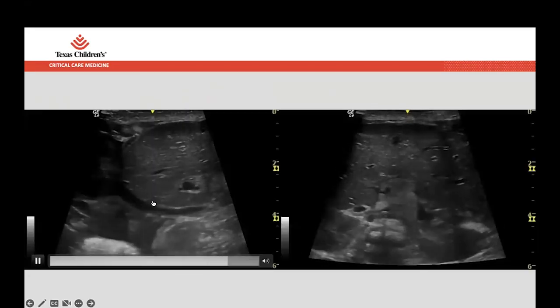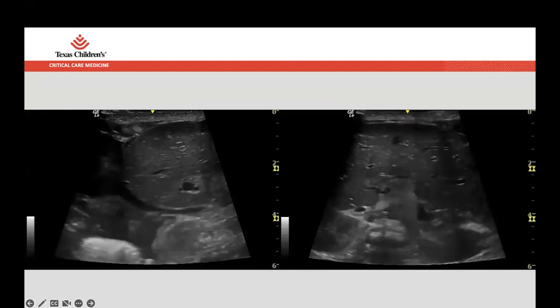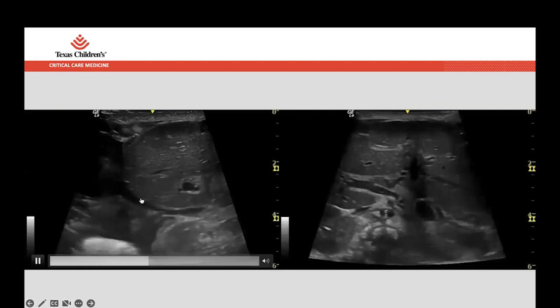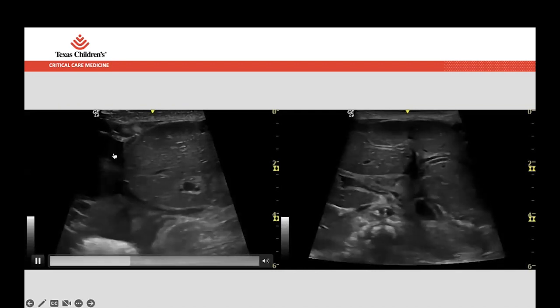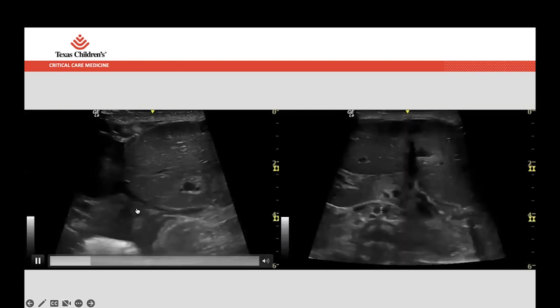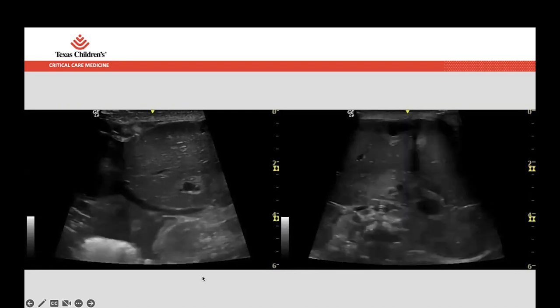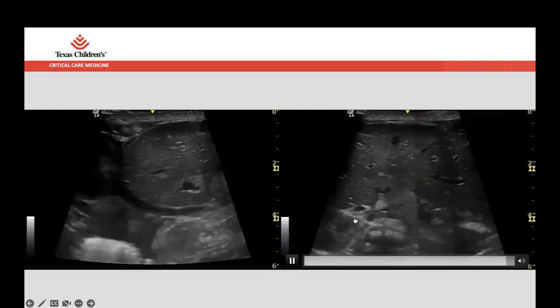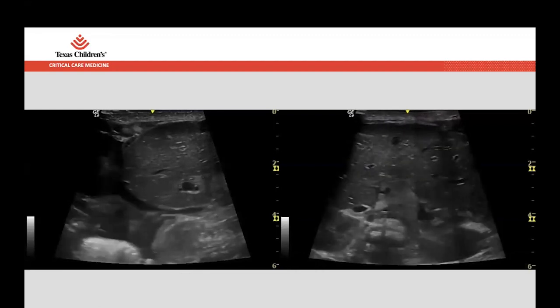You can see that also, if you look at the IVC, it's pretty collapsed as well. And we always have to caveat this; we'll be having this more in a volume status lecture later. This is a sagittal view where we have it a little bit flipped, and I apologize for that because it's a radiology convention. We have the dot oriented to the left of the screen, the RA is over here, the IVC is over here. You can see that we have near total collapse of the IVC with respiratory variation. We see the same thing over here, with collapse of that structure.